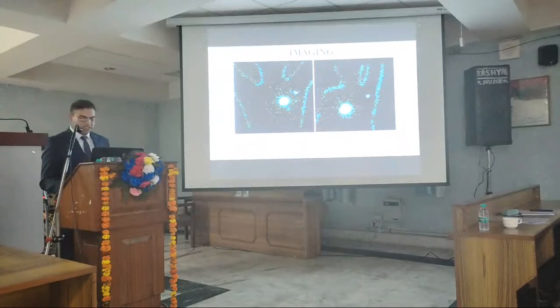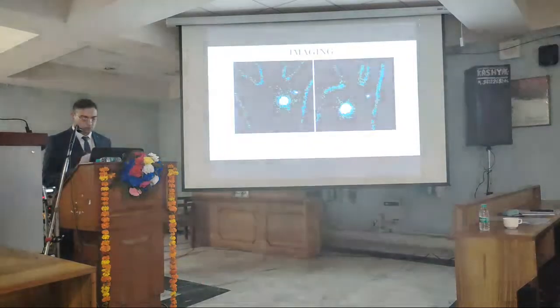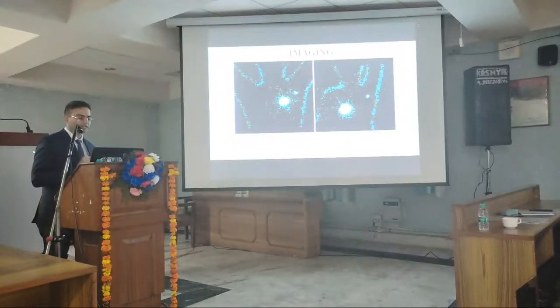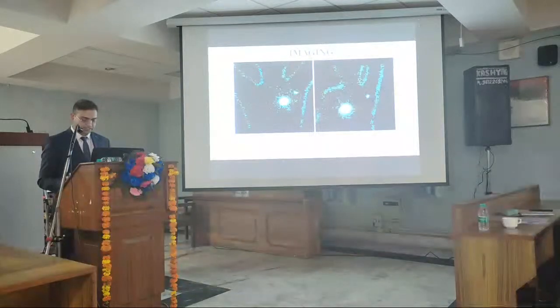Now, in planar imaging, we are not able to visualize the body contour. We are not able to localize where all these structures are. So we can do body contouring also in the case of planar imaging by a moving radioactive source. So these are the body contour images. This is the site of injection. This is the axilla, and we have done body contouring by a moving cobalt source. So we can say that the lymph node is localized in the axilla and how far it is from the skin surface. So the surgeon will get a rough idea where he has to look.